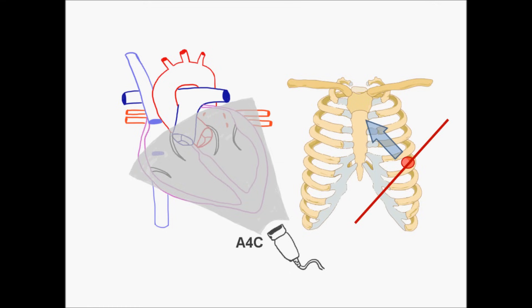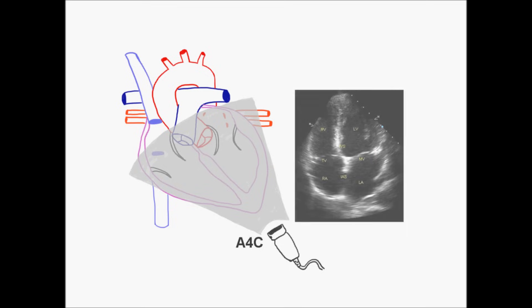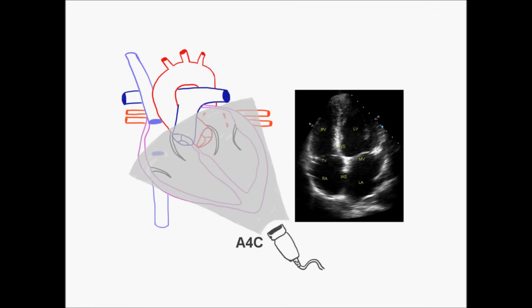Some tips for obtaining a good apical four-chamber view: have the patient lie in the left lateral position at least 30 to 40 degrees, and once we obtain the view, rotate the probe to widen the ventricle as much as possible while it's in view. This gives us a view displaying the right atrium, the left atrium, the right ventricle, and the left ventricle.